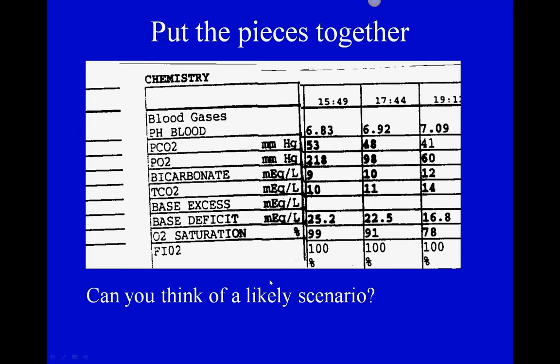likely a patient who had a cardiac arrest. And so they had a lot of CO2 produced during that cardiac arrest. They had a lot of lactic acid produced during that cardiac arrest that gobbled up that bicarb. And slowly we're going to get them better as we start to breathe for them, maybe with a ventilator, and we can regulate the CO2. Maybe we have to artificially give them some bicarb to try and correct this pH. And so this is probably from a patient who had a cardiac arrest, and this was the history of this patient. Okay, so practice those problems.